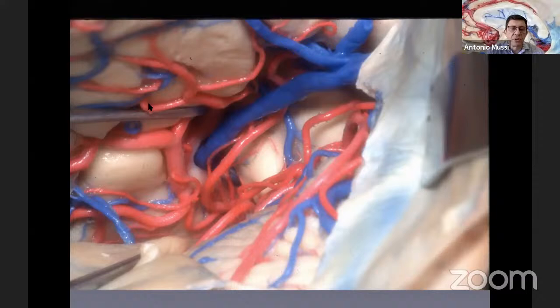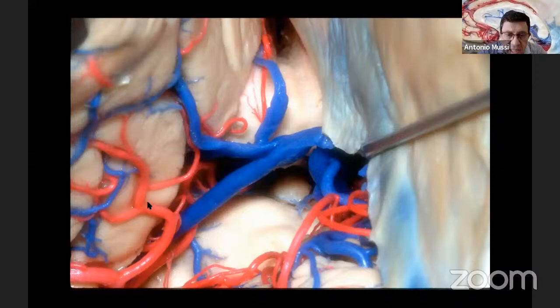So you see the branches of the posterior cerebral artery. This is going to be the calcarine fissure up here. So this is lingual gyrus and continuing here with the parahippocampal gyrus. So this approach can also take advantage of the lateral view to access, for instance, lesions on the posterior part of the parahippocampal gyrus.